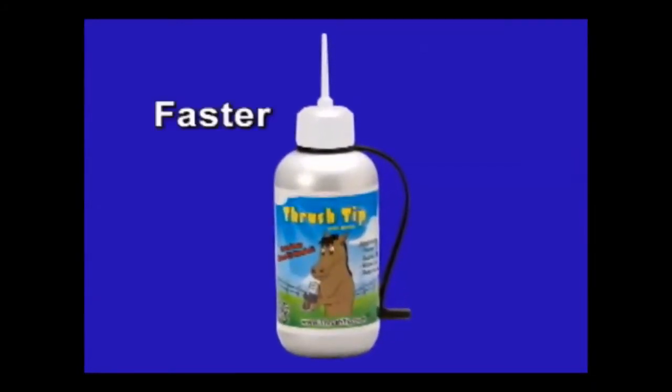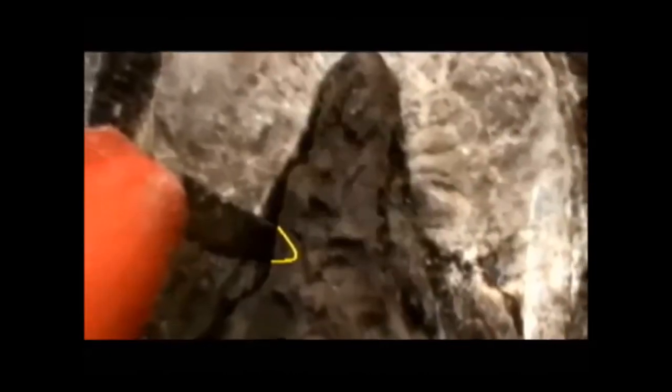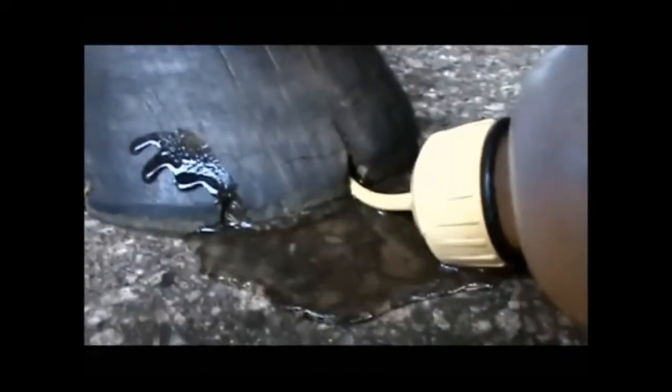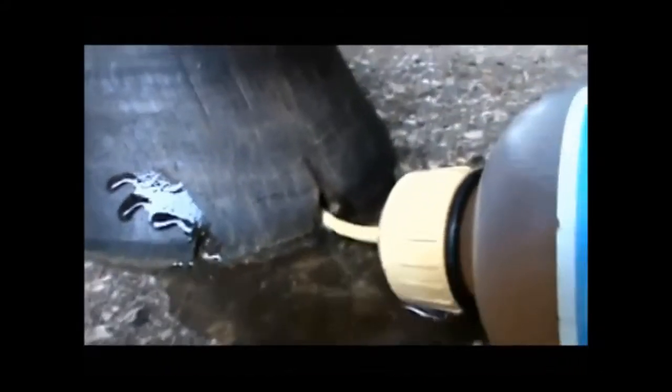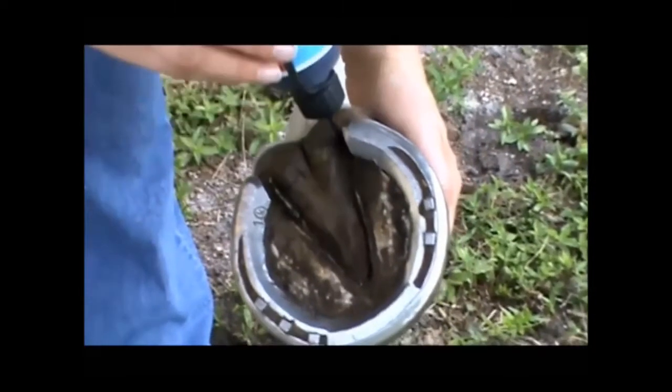Introducing the Thrush Tip Applicator. It's faster, cleaner, and a safer option that's easy to use. It's specifically designed for thin, deep cracks in the horse's hoof — like the tough heel crack between the bulbs, deep clefts that go under the frog, or holes and puncture wounds. And it's perfect for seedy toe too.